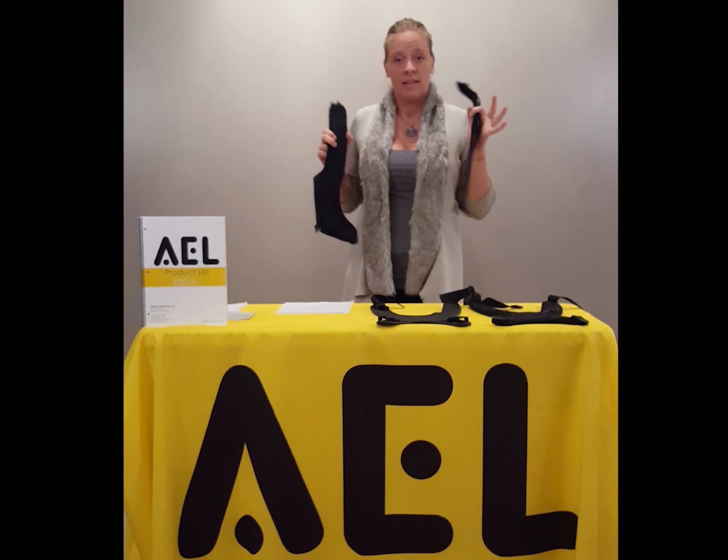The nice thing about the zippered option is that for clients who aren't capable of reaching around and undoing the clasp that you see on the stretch and the non-stretch design, this release is right in front of them. They can very easily take their hand, grab that zipper, pull down, they're out of the system. If this zipper is too small for your clients to use, you can very easily add a pull onto there or add a larger grasp, a larger tag to allow a client to grab it who has some limited fine motor skills.